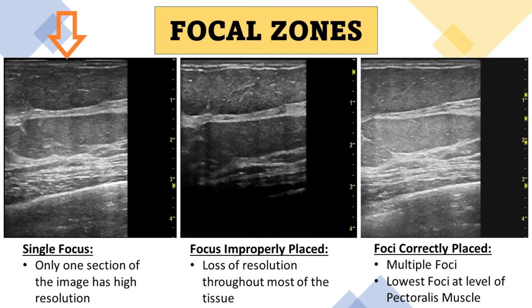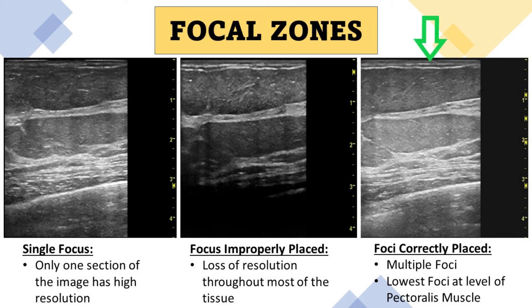In the first image, only a single focus is used, meaning only one section of the image has high resolution. In the next image, the single focus is improperly placed — it's too high in the image, resulting in a loss of resolution throughout most of the tissue and the deeper breast tissue is not visualized at all. In the last image, the foci are correctly placed, with multiple foci and the lowest focus at the level of the pectoralis muscle.